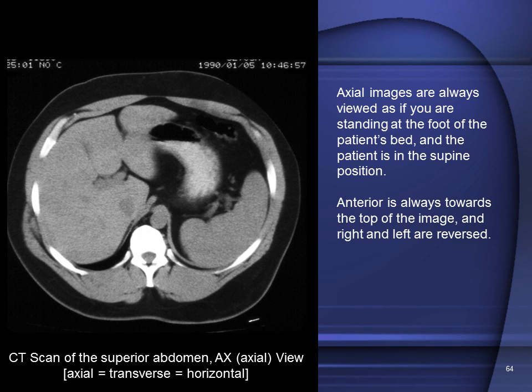And in this film, what do we see? This is a thoracic vertebral body. We can see the articulation of the head of the rib, the spleen, the stomach with the gastric bubble or air bubble, the liver, inferior vena cava, abdominal aorta, crus of the left diaphragm and crus of the right diaphragm, some of the transverse colon containing gas, and we see some fatty mesentery containing vessels going to and from the hilum of the spleen.